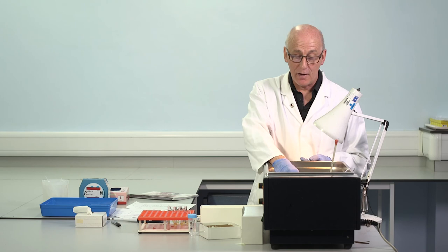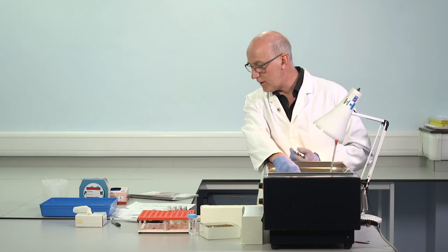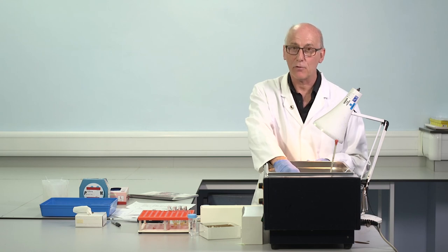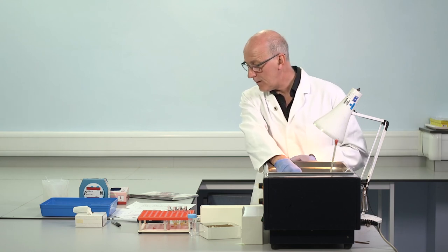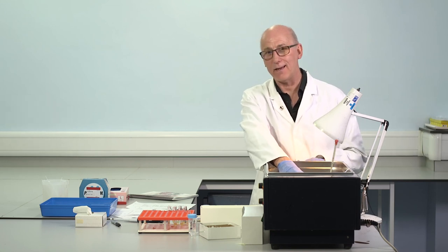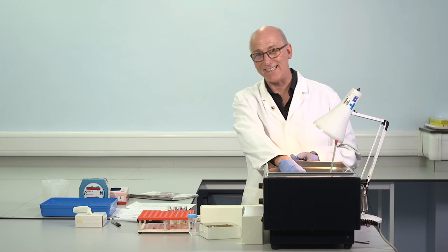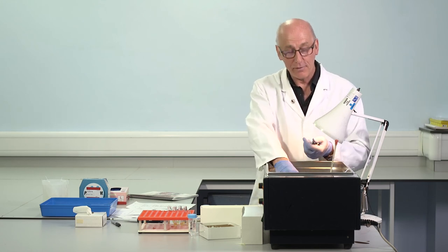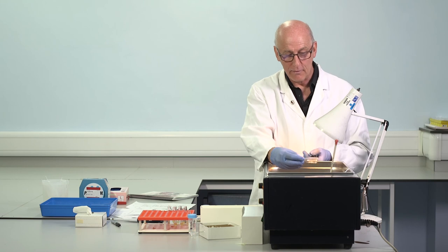So this is patient number two now, second reagent. Remember, with the first reagent, 116, 113 seconds, pretty grossly prolonged. This showed an excellent correction. Reagent number one, 50-50 normal mix, it corrected to 36. So highly likely to be a deficiency from that. Now with the second reagent, remember it's a different reference range.